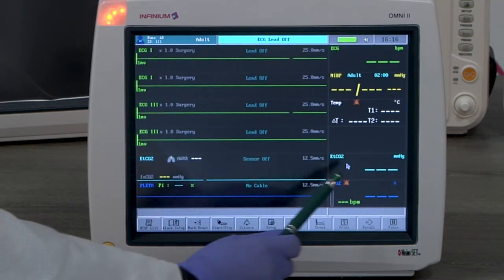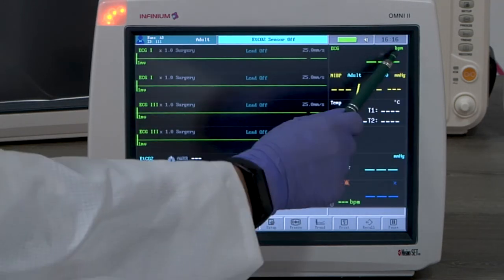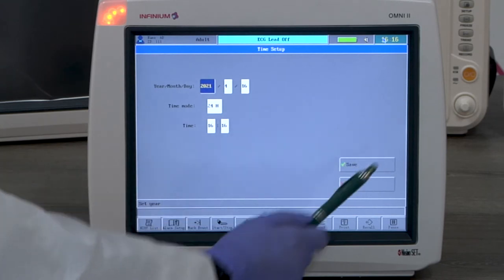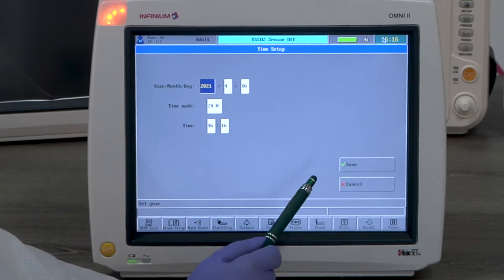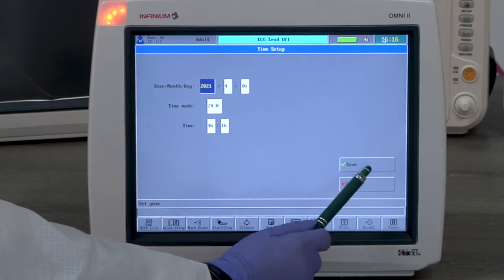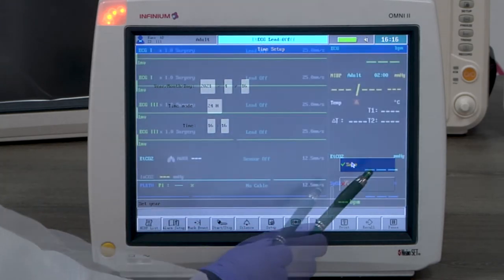Time and date. By tapping on the top right corner you will enter the time setup menu. Here you can set up the time and date accordingly.